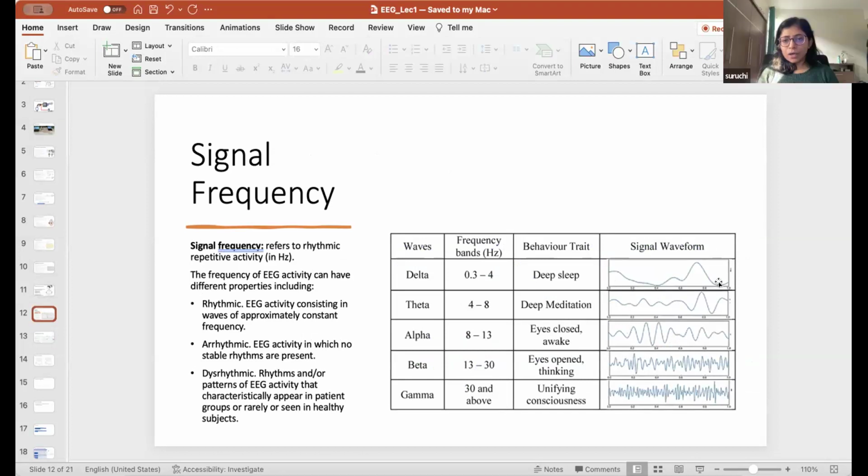So if you had 1 second data, you had 250 samples. You had 250 samples here, and when you plotted them, you only saw 2 peaks, which means the delta. Because that 250 samples was per second, meaning every second there were 250 samples. And in frequency of wave, we are talking about the number of peaks in a second. Okay, so in one sample, the number of peaks is the frequency of wave. That's what we are saying. Yes.